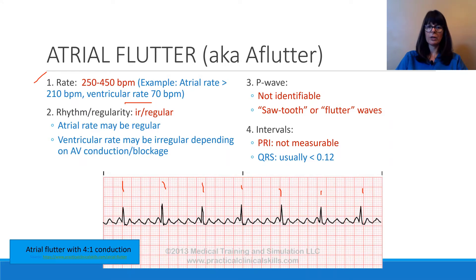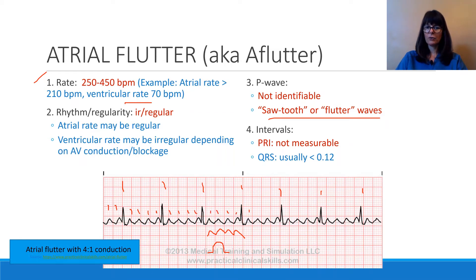These P waves have the classical sawtooth, or flutter wave, appearance — as you can see, they're kind of jagged; they're not really round as the normal P wave usually appears. If I count these P waves, I get quite a large amount: 1, 2, 3, 4, 5, 6, 7, 8, 9, 10, 11, 12, 13, 14, 15.